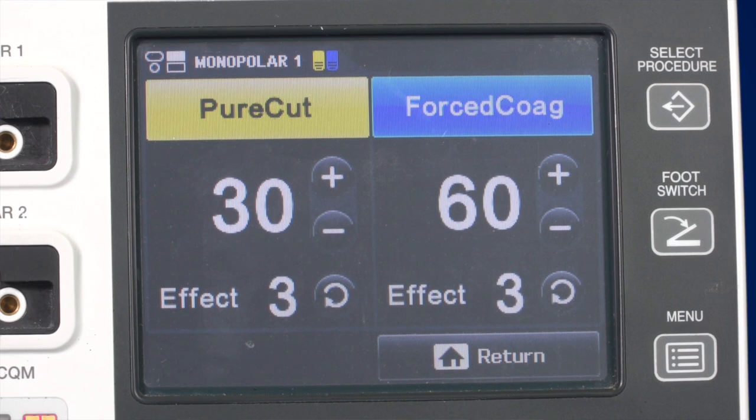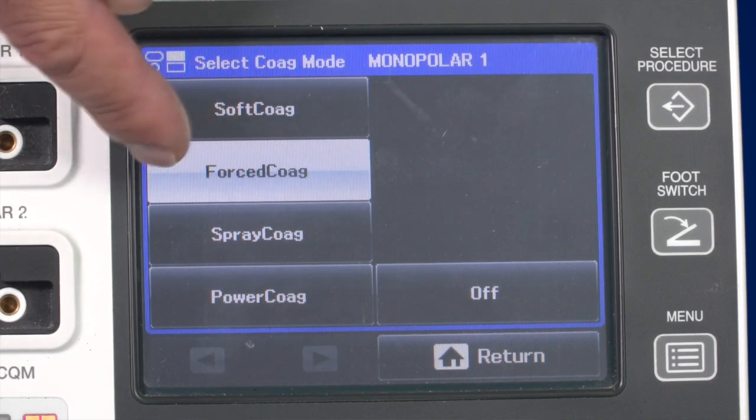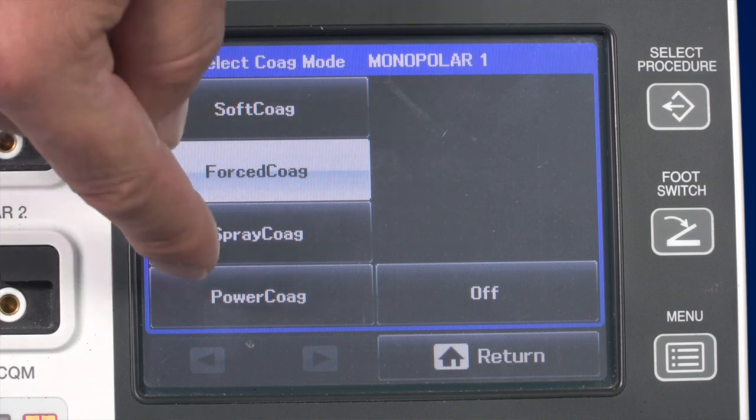There are four monopolar coagulation modes: soft coag, force coag, spray coag, and power coag. The soft coag mode is the standard mode — it produces almost no tissue carbonisation and is suitable for deep coagulation achieved by the use of forceps.